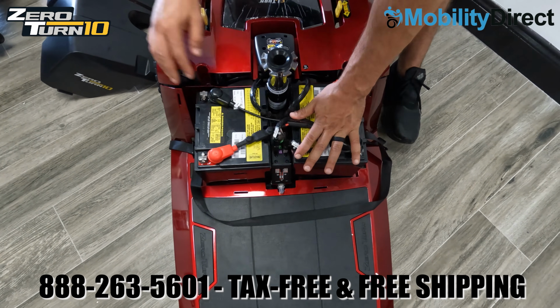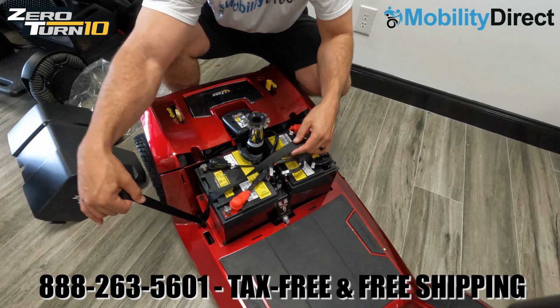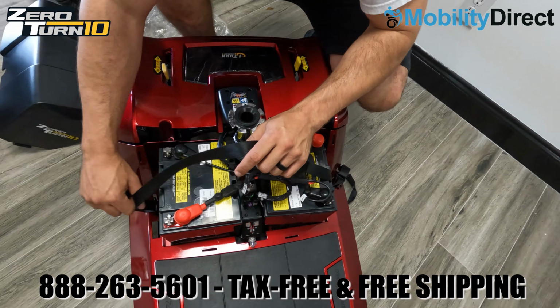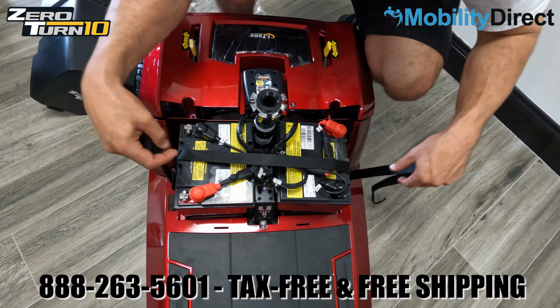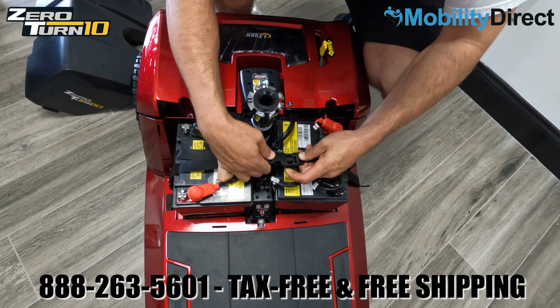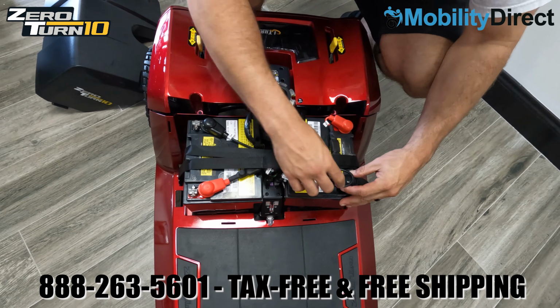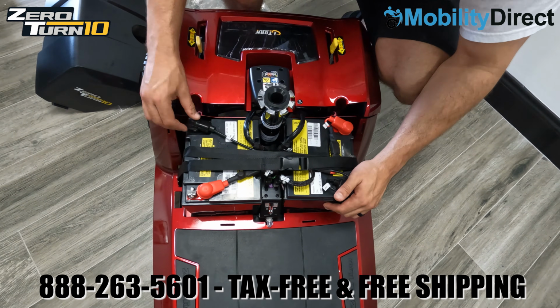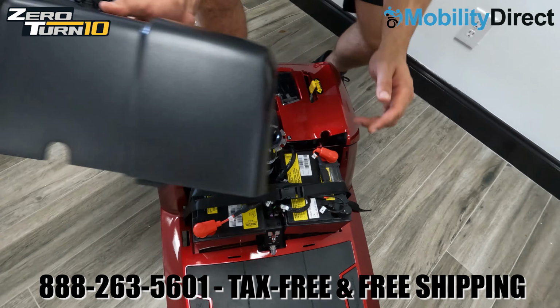Now you want to make sure that the wire harnesses are not really sprung up. You want to push them down a little bit and use the strap to push them down. You want to keep a really low profile so that those wires don't get in the way of the battery cover when you go to reinstall it. So we're just buckling in the battery strap here, making sure everything's nice and secure, putting the terminal connectors back on that we showed you earlier. They just use a nut and bolt style terminal connector.